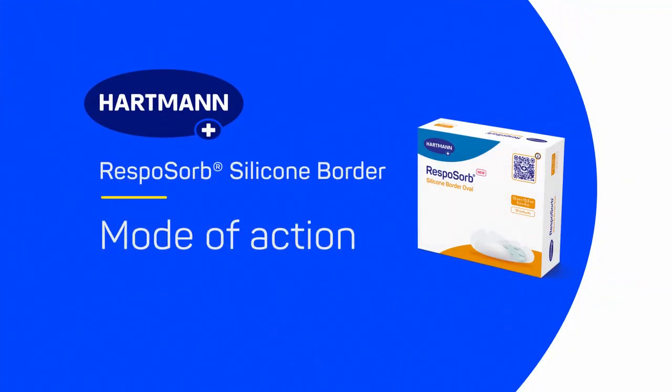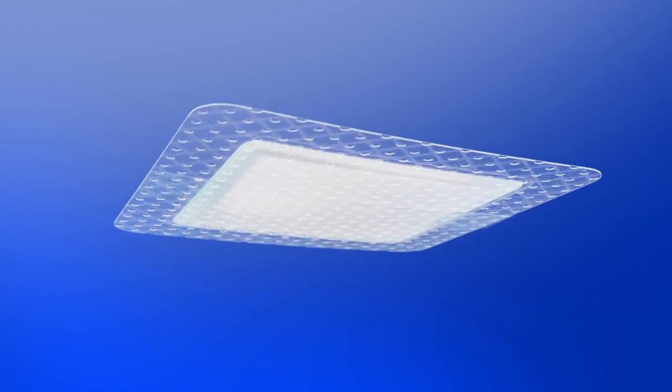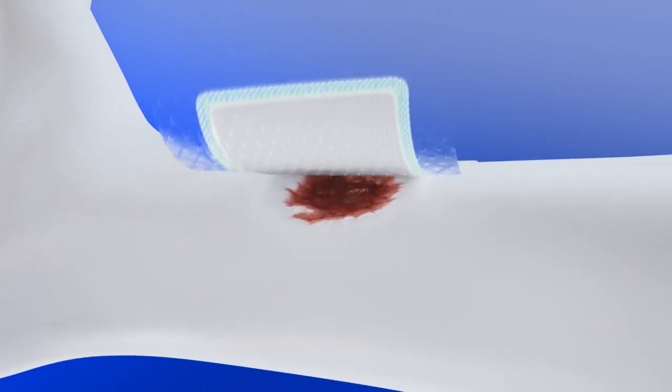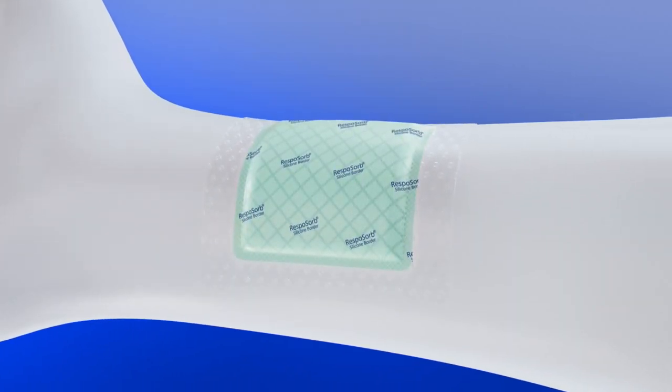Resposorb Silicon Border mode of action. Resposorb Silicon Border is a versatile self-adhesive silicone superabsorbent polymer dressing for use on a wide range of chronic and acute wounds with moderate to high levels of exudate. It is available in a variety of sizes and shapes and conforms to different body contours.